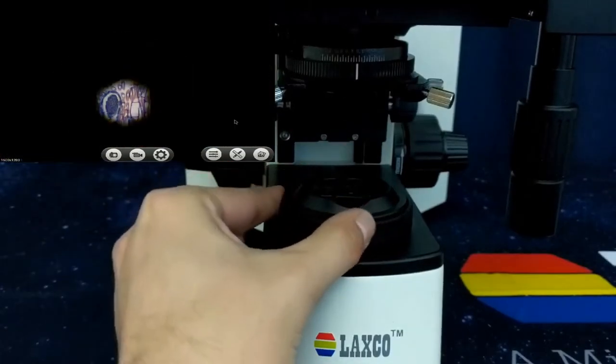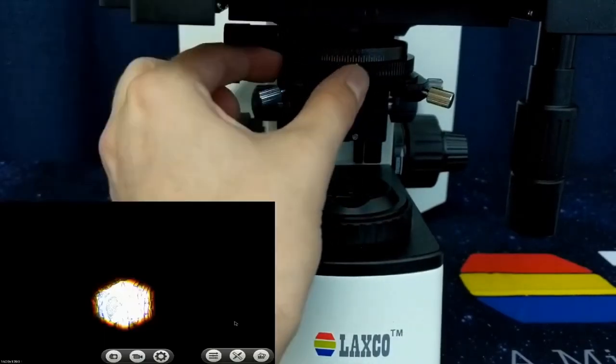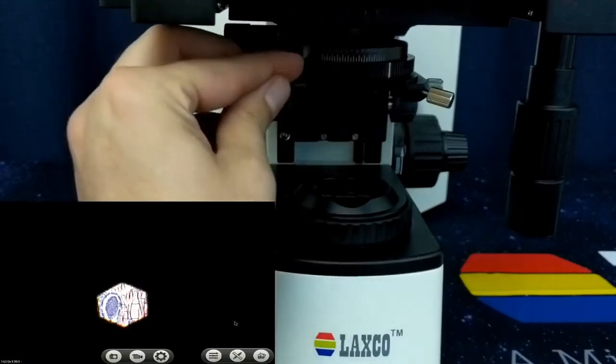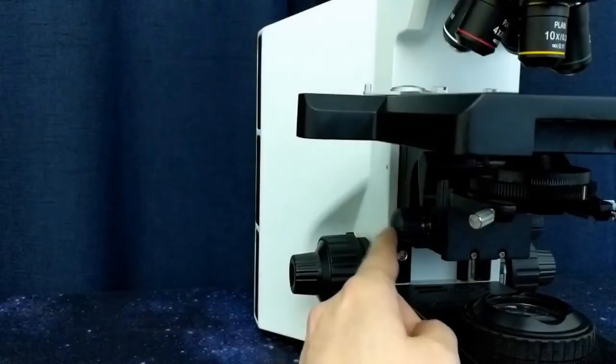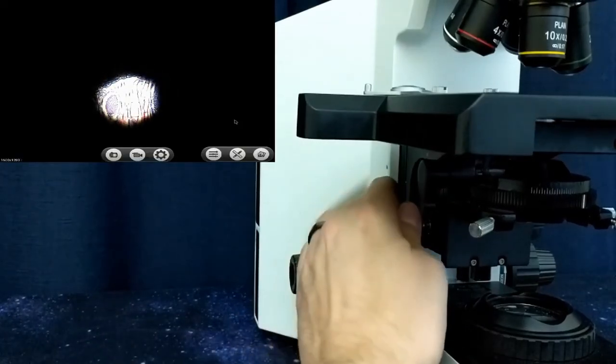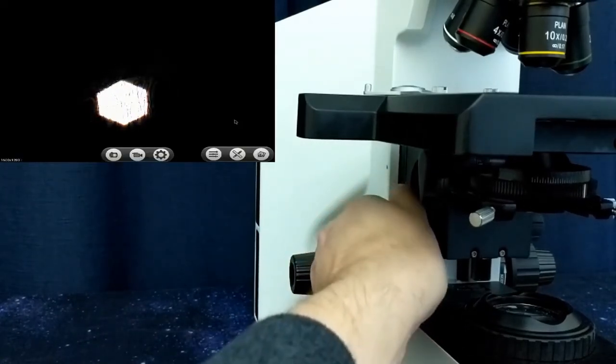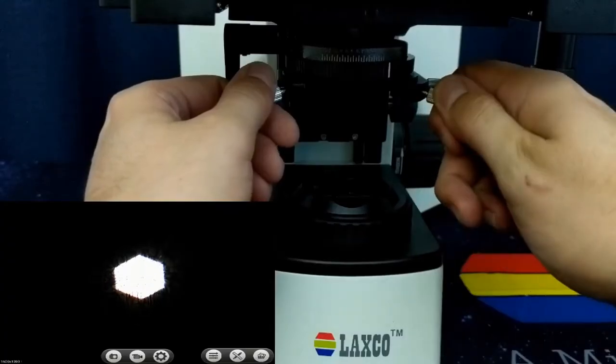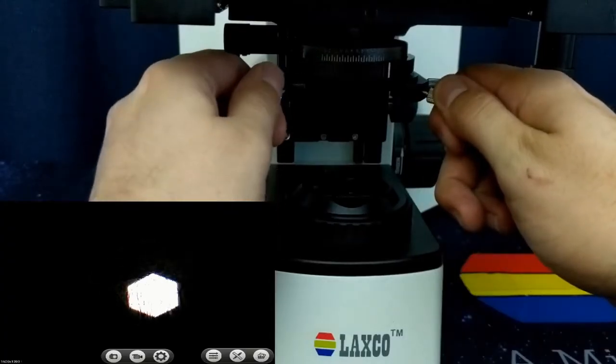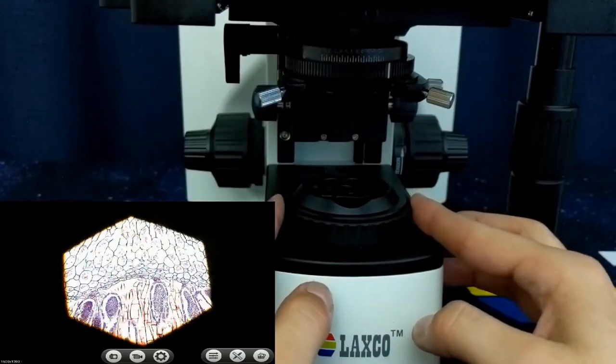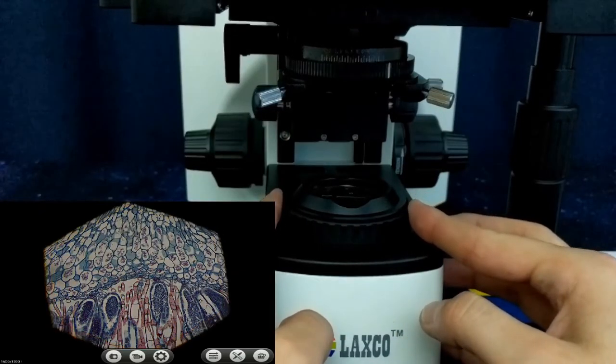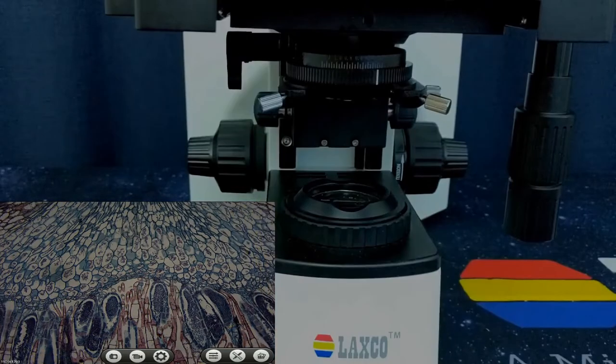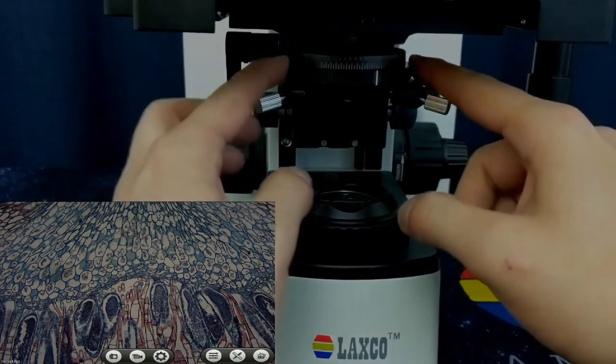Close down the field diaphragm and the condenser diaphragm as low as they will go. Using the condenser height adjuster, move the condenser up and down until there's a crisp edge on the aperture on screen. Using the condenser positioning screws, move the image of the aperture until it's in the middle of your screen. Open up the field diaphragm to check that the edges are going off the top and the sides at the same time. That means the microscope is in alignment.